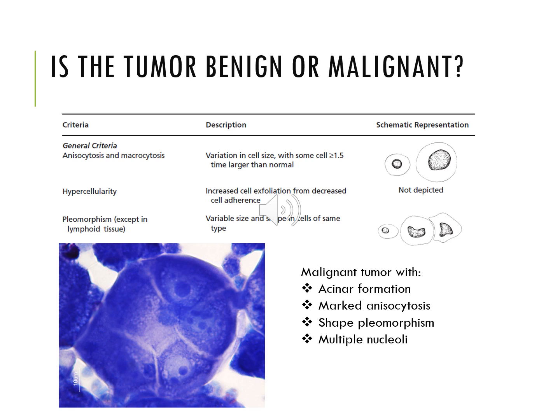Something else we very frequently look at is how pleomorphic the cells are, or how variable in shape they are. If there are marked differences in size and shape, then it's said to have marked pleomorphism. Again, in this image at the bottom here, some of these cells differ greatly in cell size and cell shape.